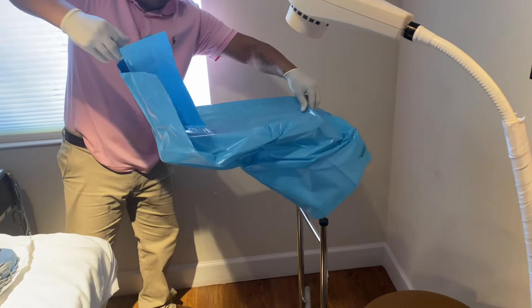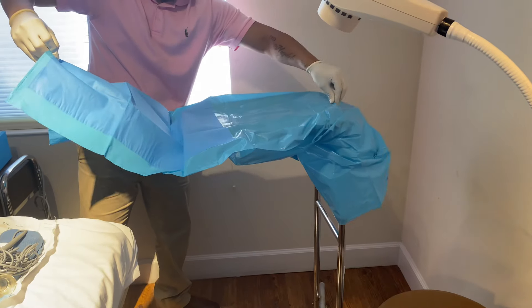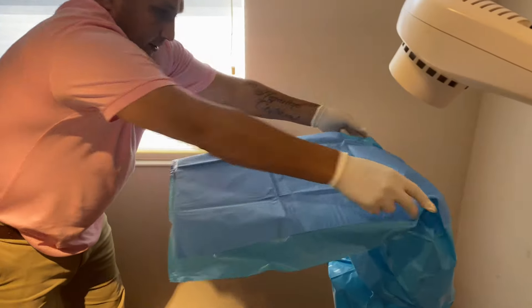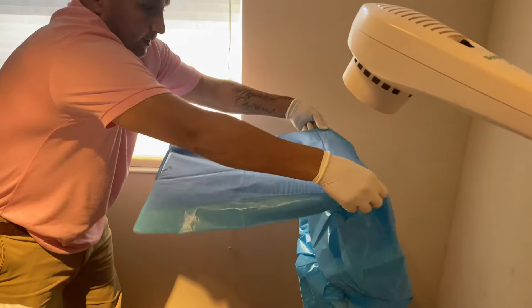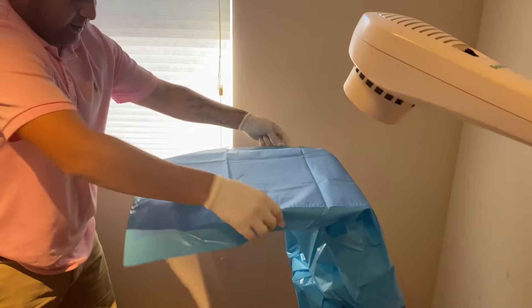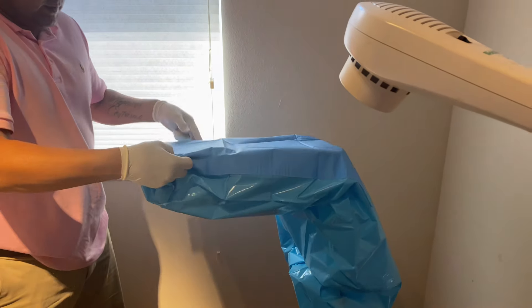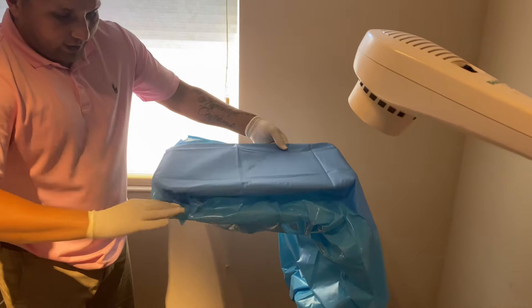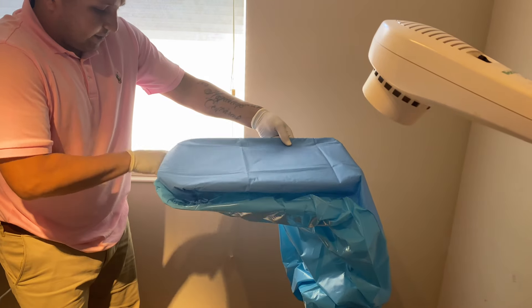The most important sterile field is this — everything is still sterile, nothing has been contaminated. Let's pour it in. You can leave it like this if you like, but I like to pour it in so it looks a little neater. Pour it into the cups. Nothing has been contaminated.